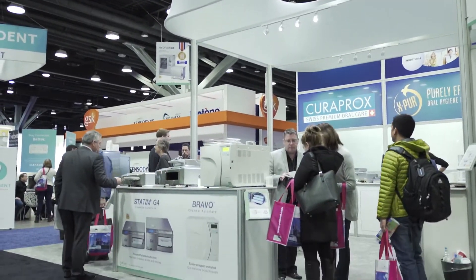We're here at PDC 2018 at the ADEC booth talking with Ted Gray from SciCan. Ted, thank you so much for taking the time. My pleasure. There's been an awful lot of talk, discussion, and concern over the whole area of sterilization. Perhaps you can tell us a little bit more about the steps involved with instrument reprocessing.